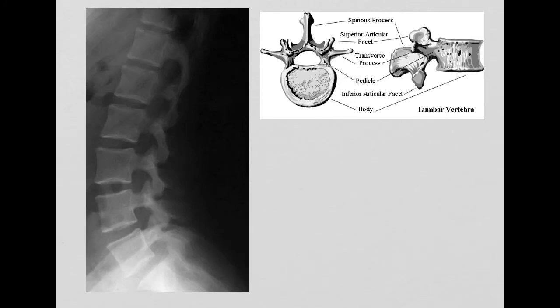Today we are going to be looking at the anatomy of the lumbar spine, and we are going to start with a lateral view of the lumbar spine. To your left will be the X-ray image, and to your right is the drawing or schematic that we will use to identify individual structures on each vertebra.